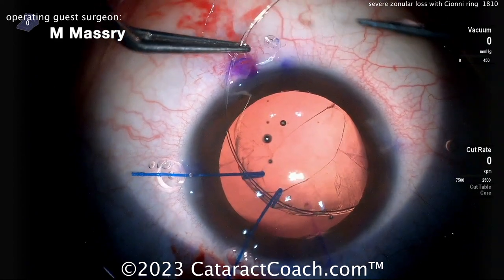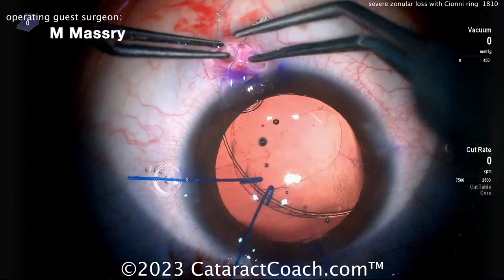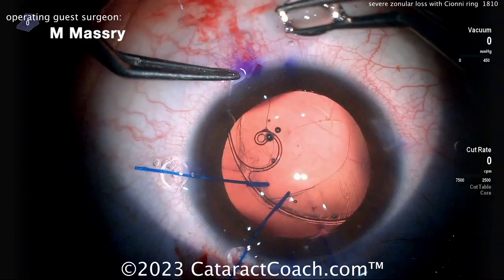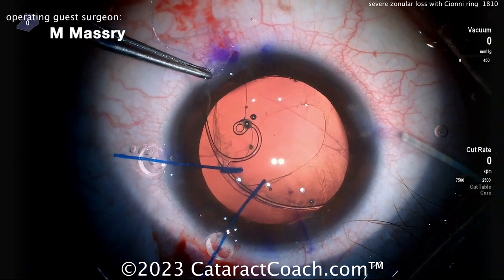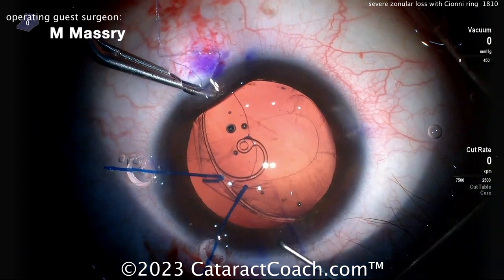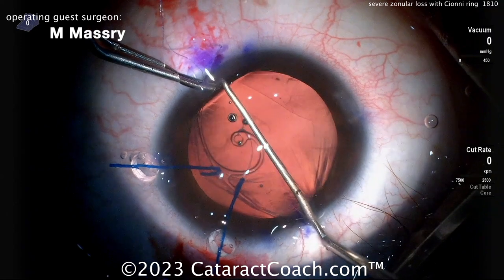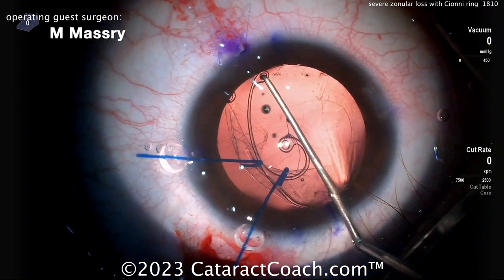You can see there's a little bit of stress on the bag — look what's happening on that rhexis edge. You've got to be careful about damage. Here comes the Cionni ring getting inside the eye. Here's where you want to use a Sinskey hook at the other incision — just grab it and gently dial it in the bag. You want that Cionni ring, the ring part, to end up in the area of zonular weakness to provide the most support. There it is with the Sinskey hook — smart move.